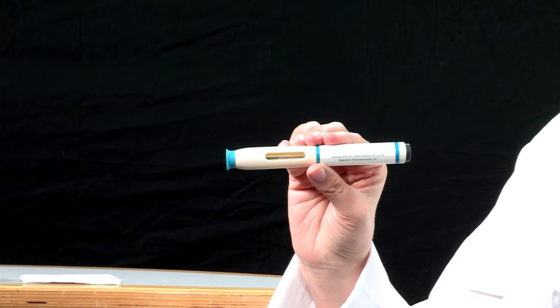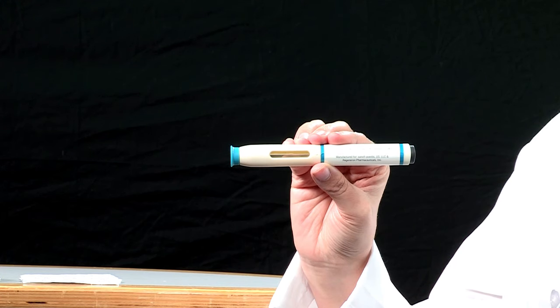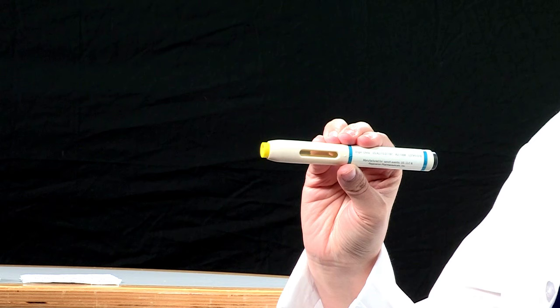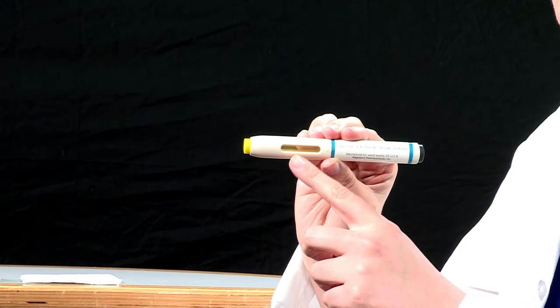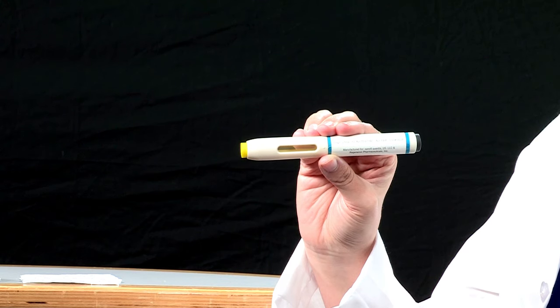Before we discuss how to self-inject Aliracumab, let's first take a closer look at the medication. This is called the Aliracumab autoinjector or pre-filled pen. It has several components. The blue cap will need to be taken off just before you give yourself the injection. The yellow safety cover has the needle hidden inside it — do not touch the yellow safety cover. The medication window shows the medicine, which should be clear, colorless to light yellow, and free from particles. The medication window will change to a solid, bright yellow color after you've injected the medication.